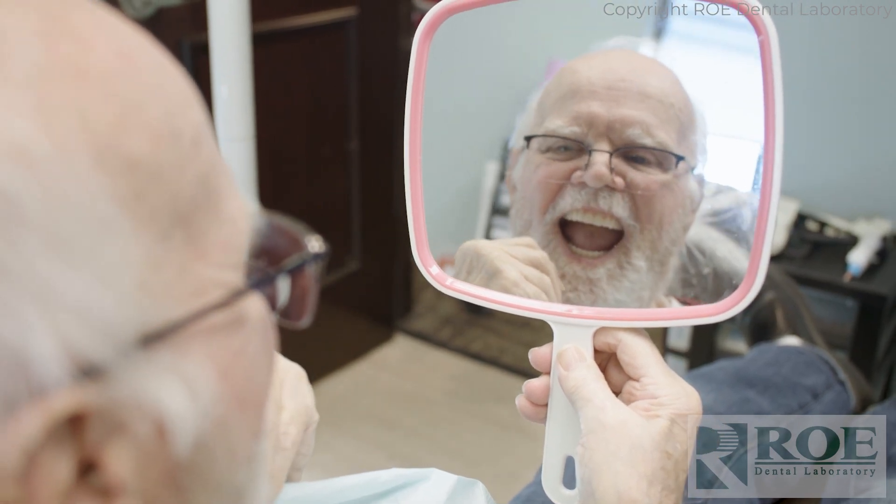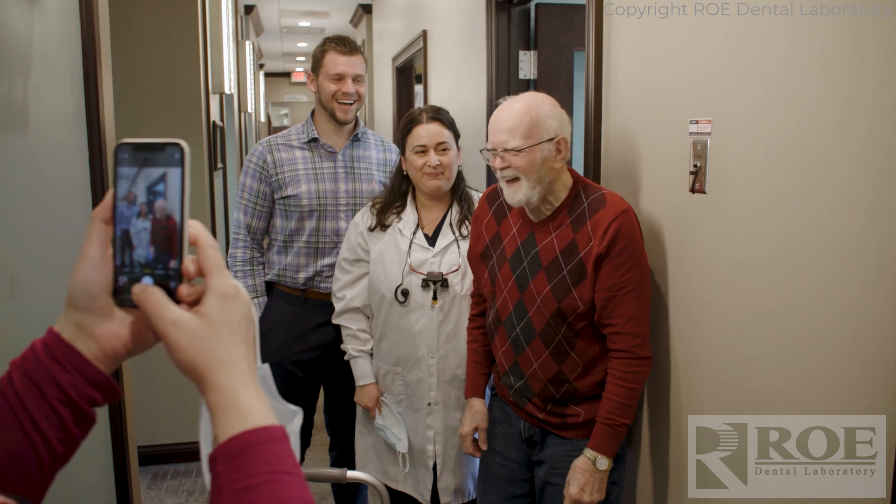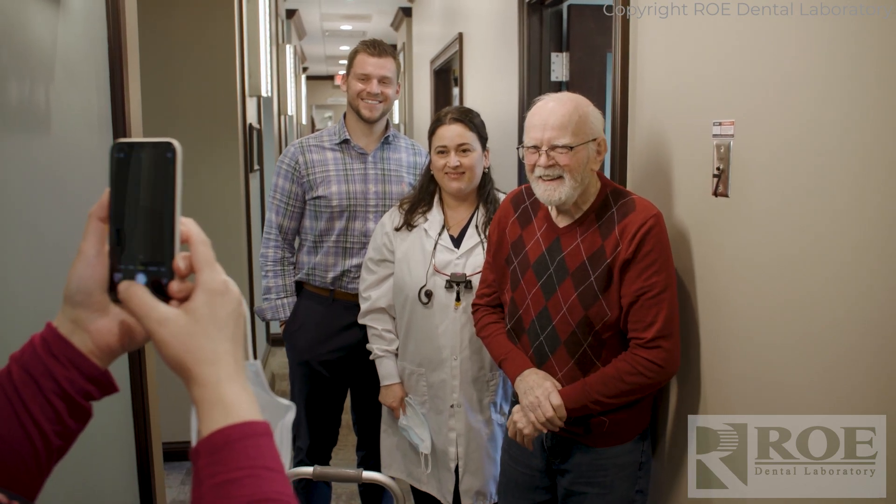Today's visit was really easy and didn't take that much — I didn't even have to adjust much. He kept looking in the mirror, he was smiling. It was really rewarding to see a smile on his face. Elmer is like my father to me. I treat him like he's my own family.